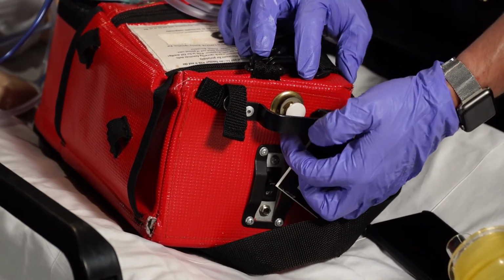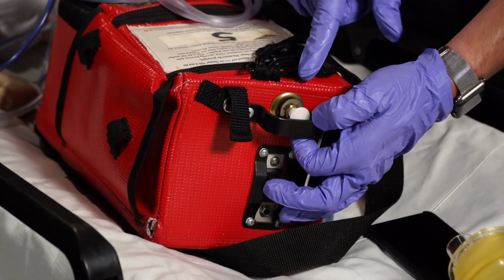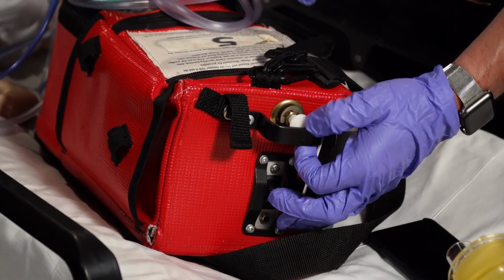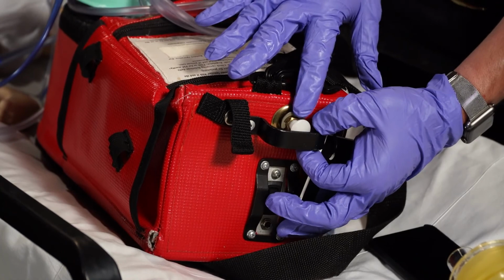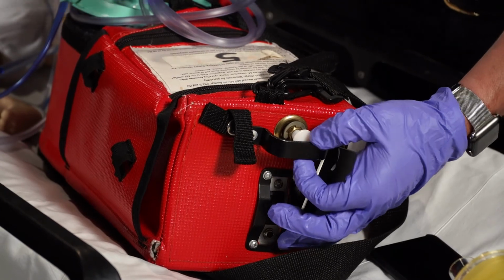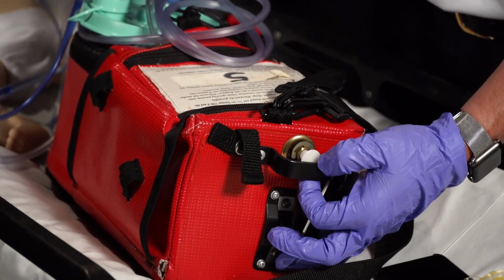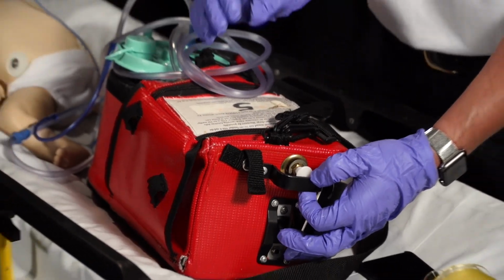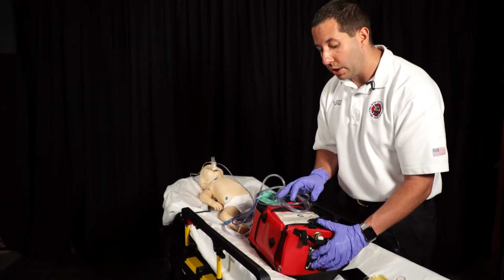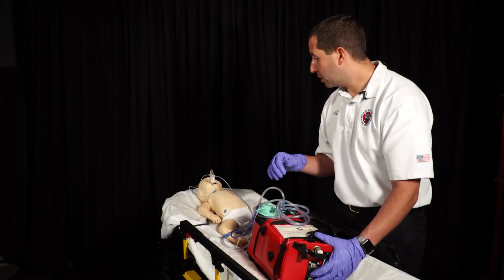Before you turn on the suction device to suction some of the air out of the belly, you want to make sure that you pull out your low pressure switch. This is designed to give a reduced pressure while performing suction to the belly. There's a very big difference. Without that low pressure switch pulled out, this device can deliver up to 525 millimeters of mercury of pressure. With it pulled out, it delivers roughly 125 millimeters of mercury. That can make a drastic difference. When they do it in the hospital, it's at a very low setting, 10 to 30 millimeters of mercury of pressure. So please make sure that you pull the low pressure switch out, and only do it quickly, just to drain the belly or pull the gastric content out. This should be very short, and this could be done throughout the call.